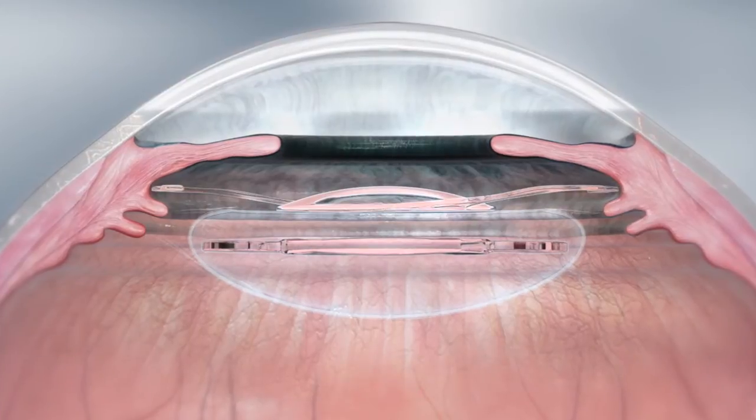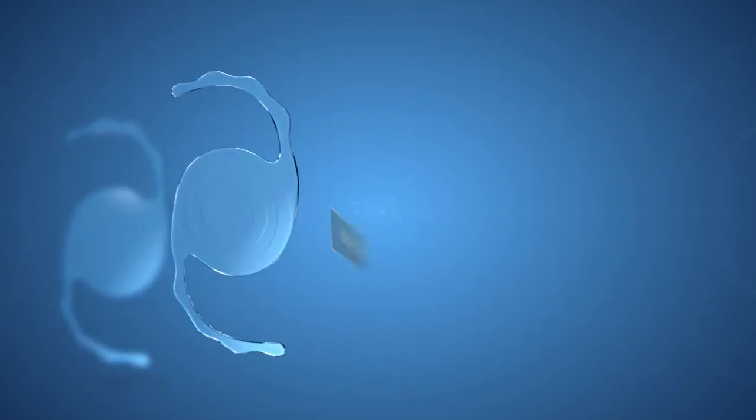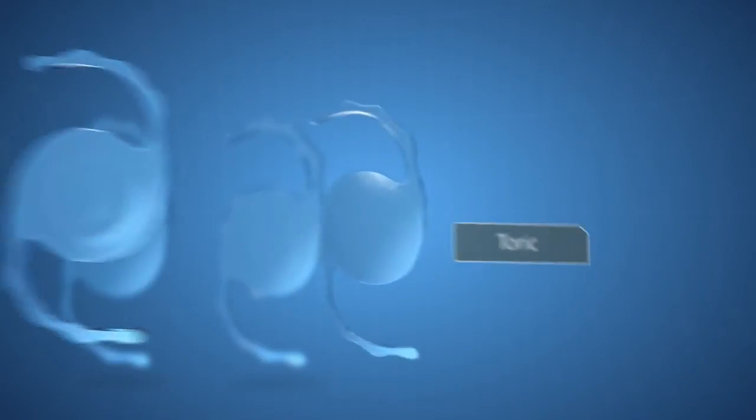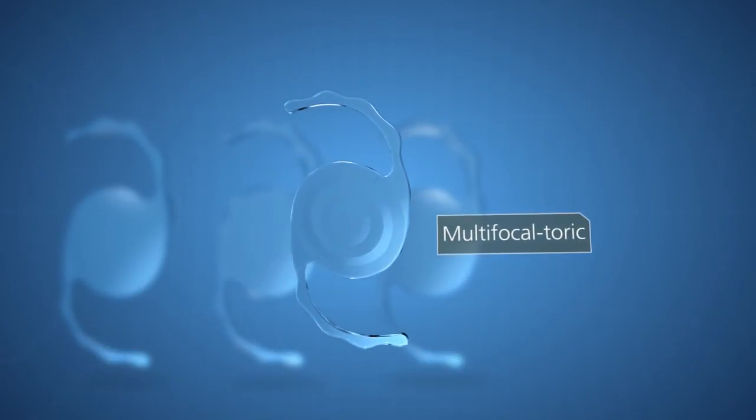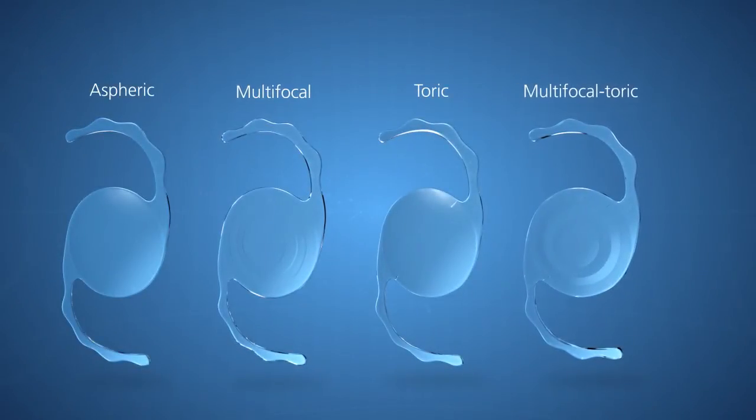Four different optic designs offer multiple options for ametropia correction: aspheric, multifocal, toric, and a combined multifocal toric optic, giving you the opportunity to treat patients who may have had few options in the past.